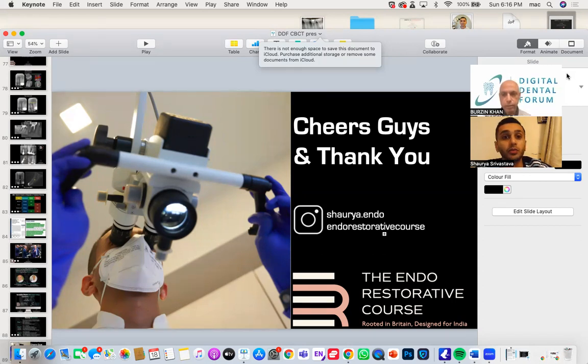To know more about it, check out the paper from Moreno. There's a review of literature on that. I think it's 2019. He has a two-paper sequence in the IEJ. So have a look at that, and if you have any more questions, please feel free to ask about guided endo.